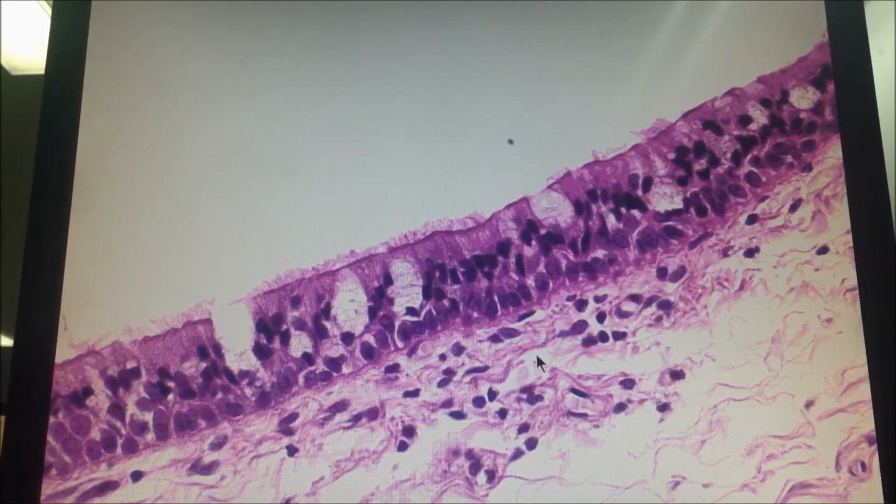The connective tissue اللي underlie the epithelium always بيكون نوعه loose. It's a loose connective tissue. تحت الepithelium of the tracts you will always find loose connective tissue، ودائما بتسميه lamina propria. فالlamina propria هي loose connective tissue that underlie the lining epithelium of the tracts. شو معنى loose؟ Loose connective tissue يعني قليل الfibers وكثير الخلايا, a lot of cells. Minimal amount of fibers and matrix and a large amount of cells.